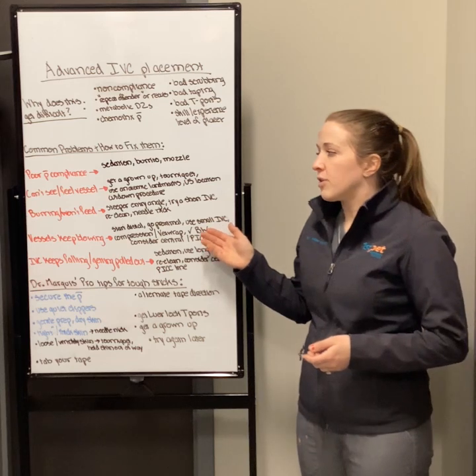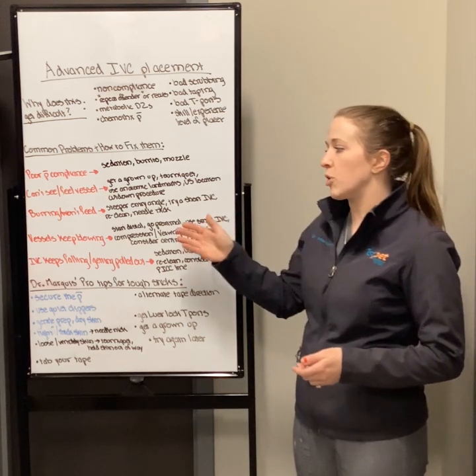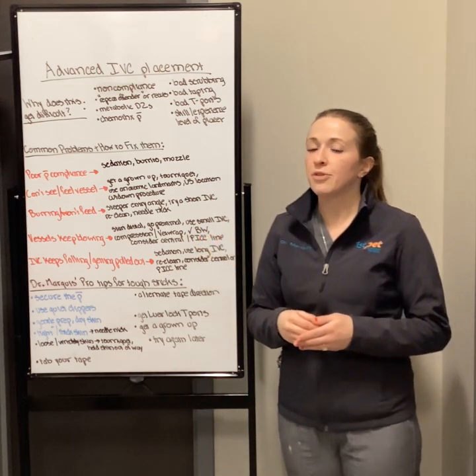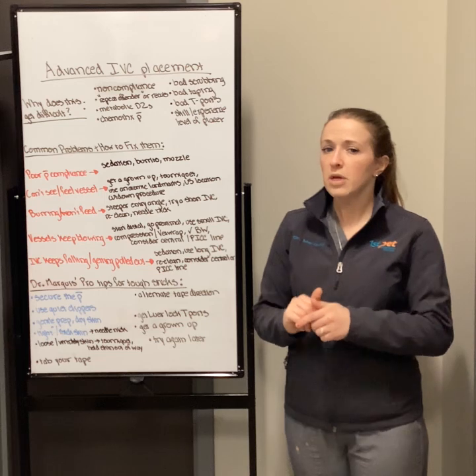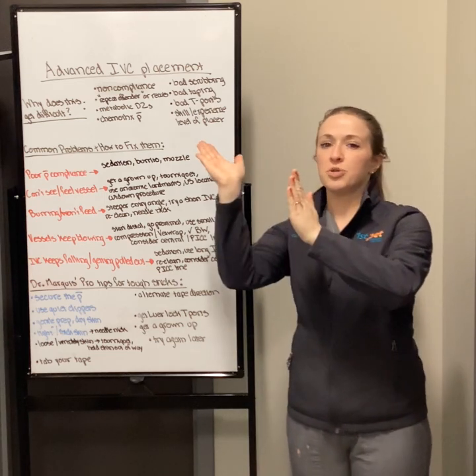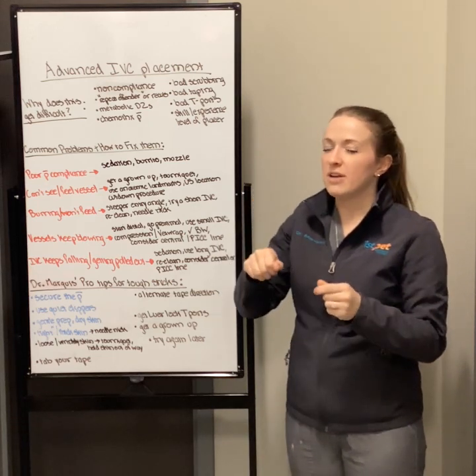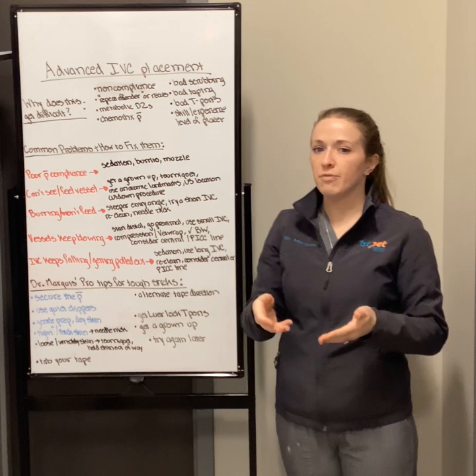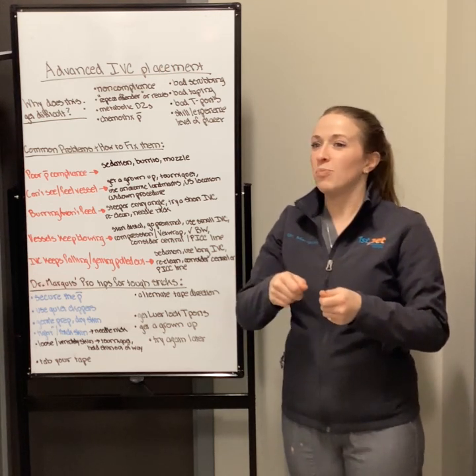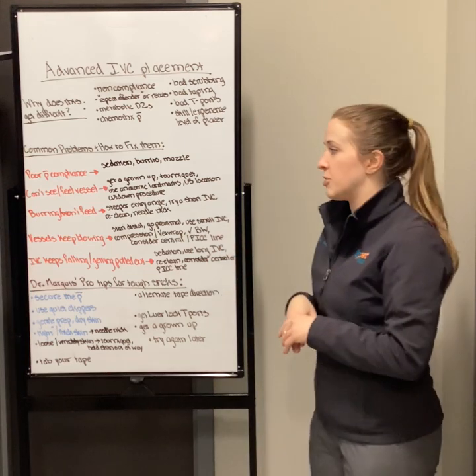Can't feed the catheter is one of the problems we see, like burring, or the catheter won't feed. Burring usually means that the catheter has sheared off of the stylet. Usually what you'll see is that the white portion of the catheter has kind of sheared away, maybe torn off. And usually it feels very gritty underneath the skin of the dog or cat. You'll feel it get gritty, and you'll be like, oh, it burred. And then the area starts blowing or developing a little hematoma.